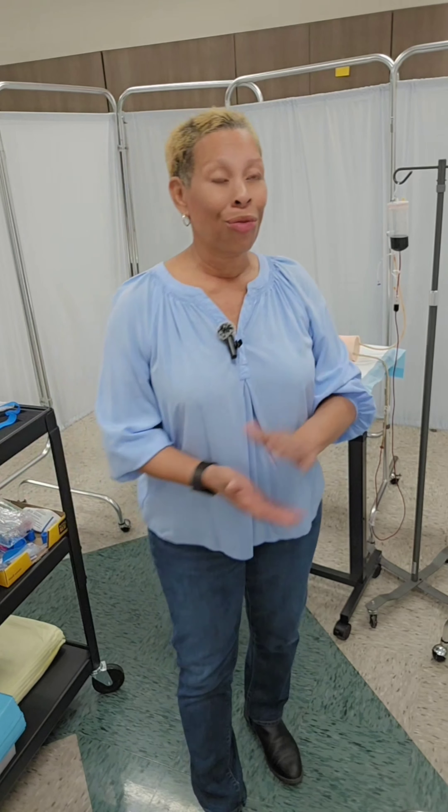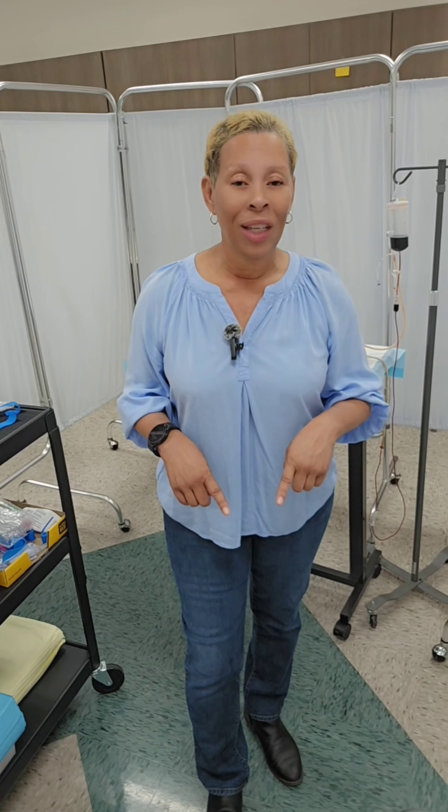What's up everyone? Nurse Jar here. I am thrilled to be here with you today because in this video I'm going to be showing y'all how to do venipuncture. Yes, this is my first nurse training video and I'm super excited.